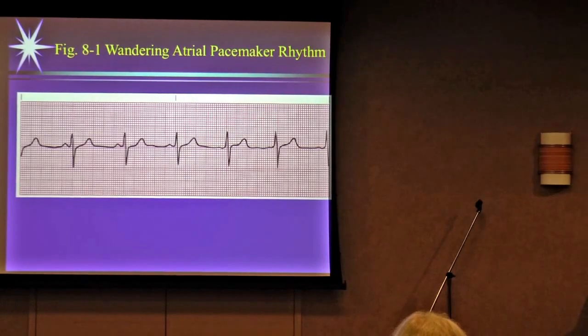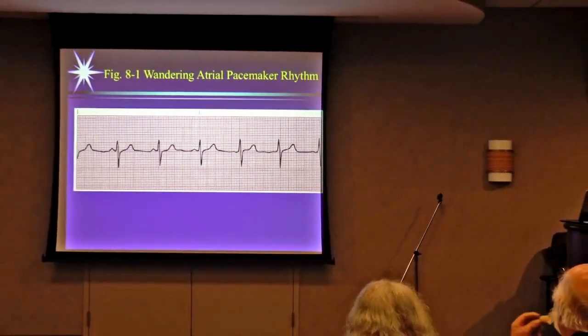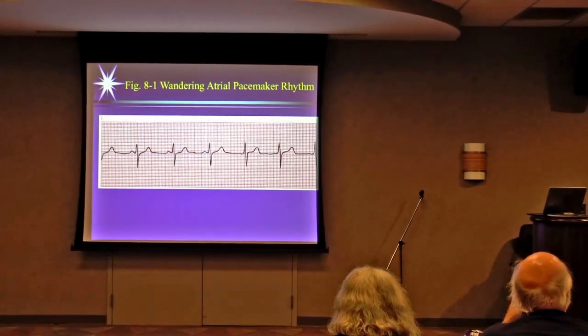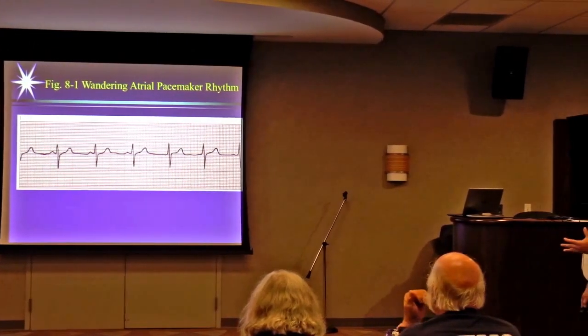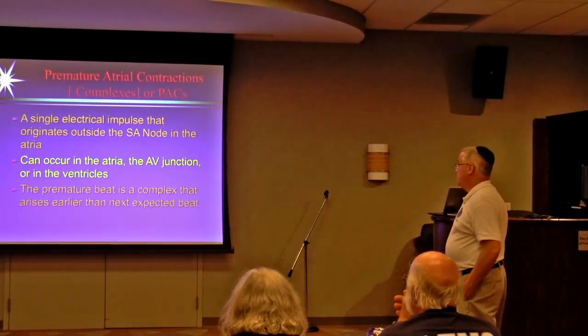The only variation for this is if the heart rate goes above 100, then instead of calling it wandering atrial pacemaker, we call it multifocal atrial tachycardia, only because the heart rate's above 100. Okay, there they can be a little more symptomatic just because the heart rate's increasing and stuff like that.